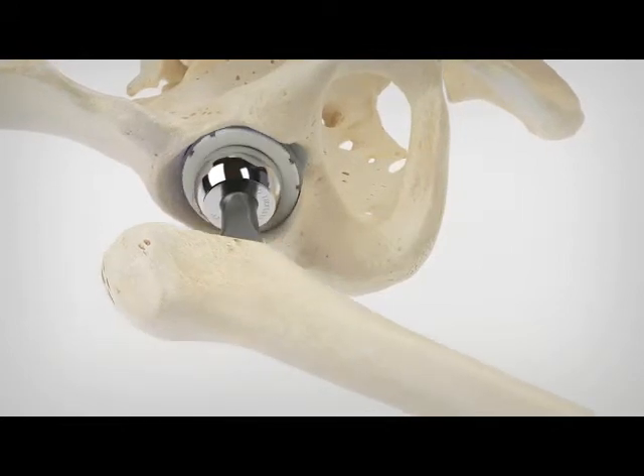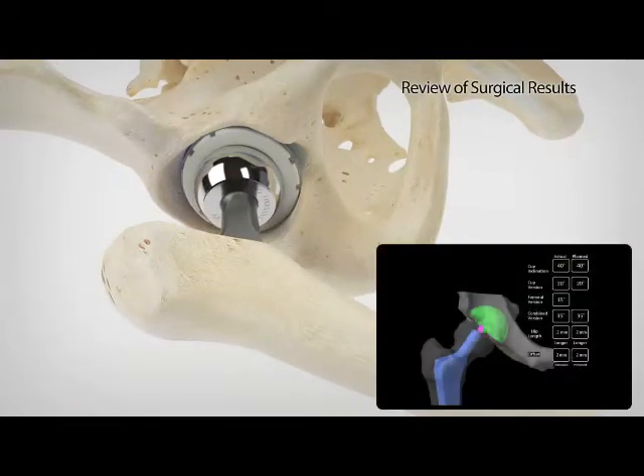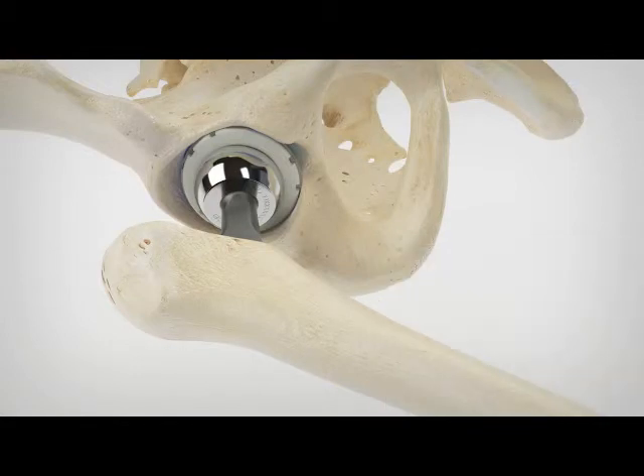Rio also assists the surgeon in determining when the cup is fully seated. Surgeons can then evaluate the position of the implant and the post-operative leg length before leaving the operating room with a new level of confidence using robotic arm technology.